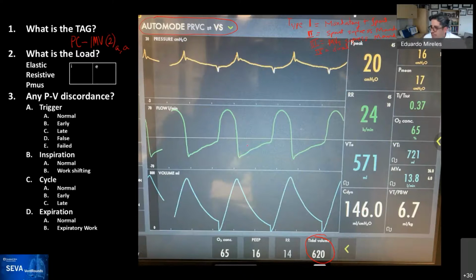Alrighty, I see a question. In type 1 and type 2, the processor sets a window for the sensing time epoch, that is the opportunity window for the BE detection in 3 and 4. Yes, so for type 1, there's a synchrony window. There's no question about that, so that it synchronizes with the patient effort, but they will still deliver the breath.